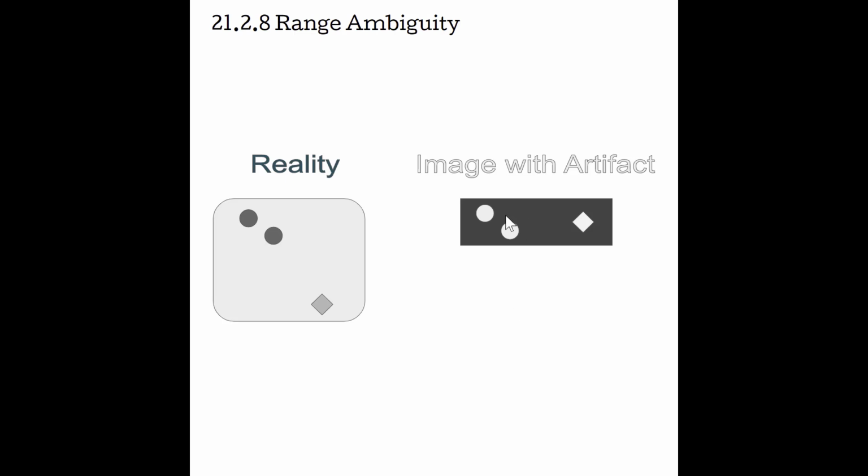So a pulse is sent out and this image is created. The sound keeps going and might interact with a deep set reflector. Those echoes will eventually make it back to the transducer, and the transducer is going to think it came from the shallow area and place it in the image. So the easiest way to correct for this then is to just increase your depth so you are giving the machine a little bit more time to process all of those echoes returning.